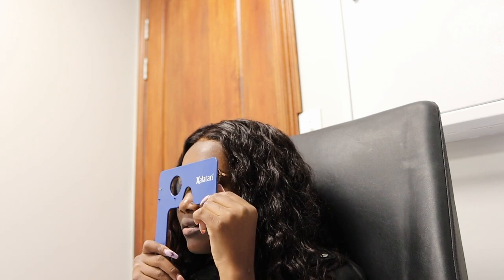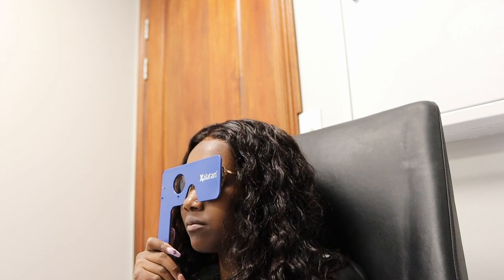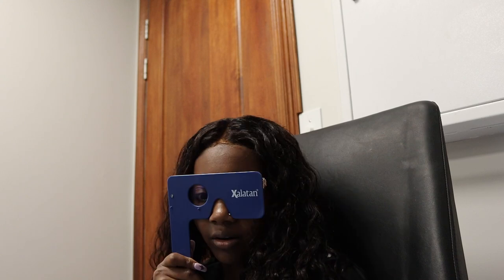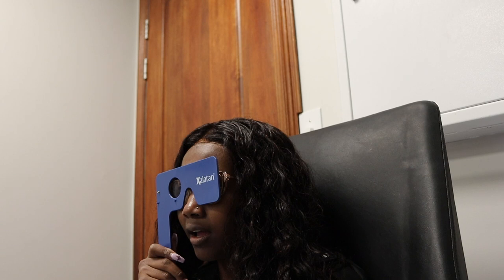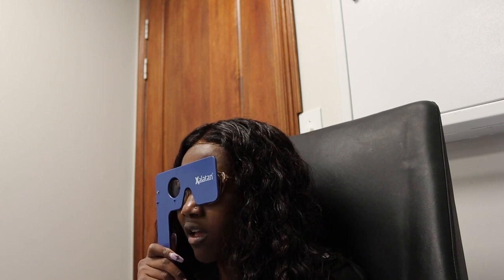Glasses on. And then use that again. Cool. On my left. Right side, please. Right side. Yeah, GK. TPZHC. VDAFE. SBNKR. NAROV. TZ. PLS.